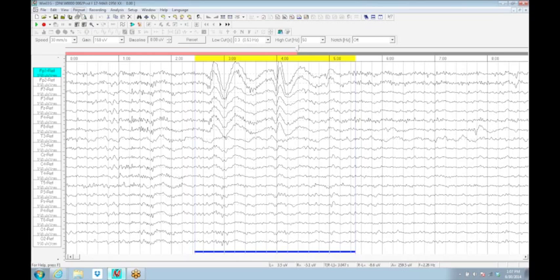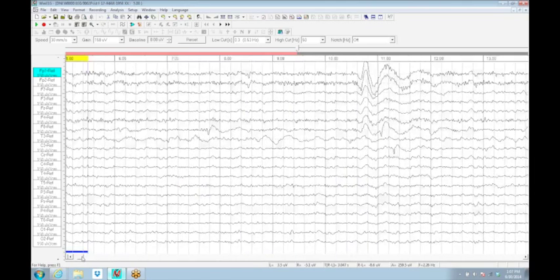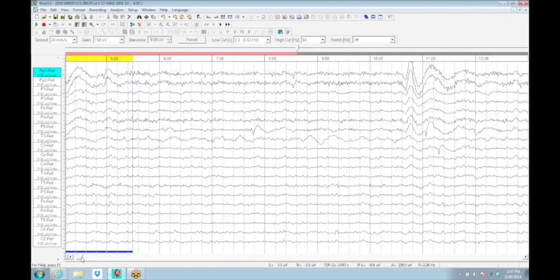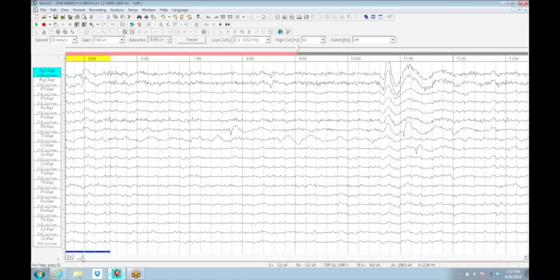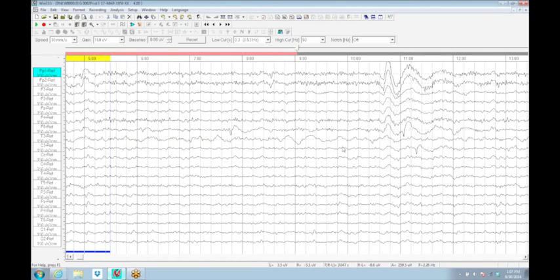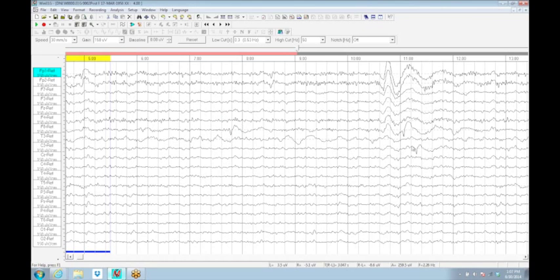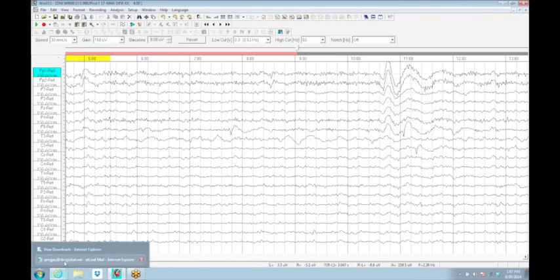It's preferable to simply mark them. Those marks can be changed at another point, but if you erase it, it's irretrievable. You can see the slight electrode irregularity at T3, the electrode pop at F8, another small electrode which repeats itself here, and a small electrode pop at C3.